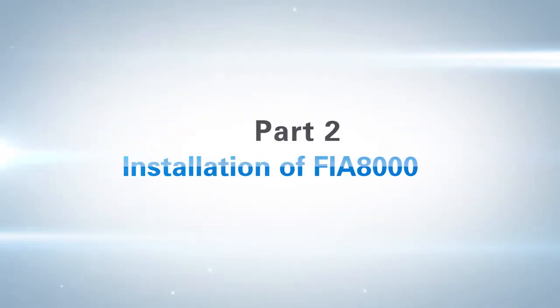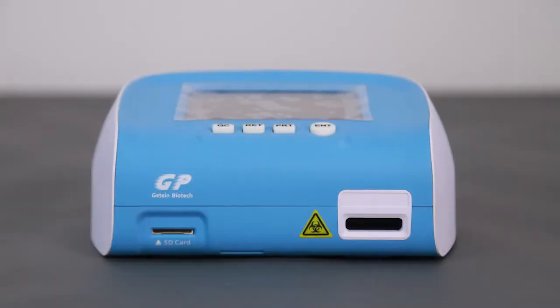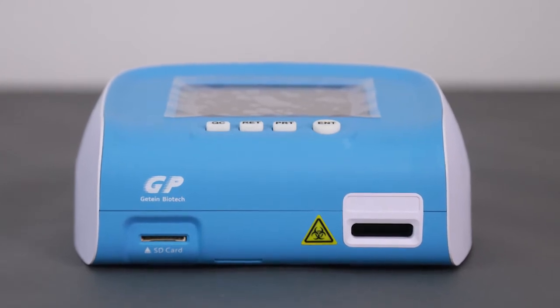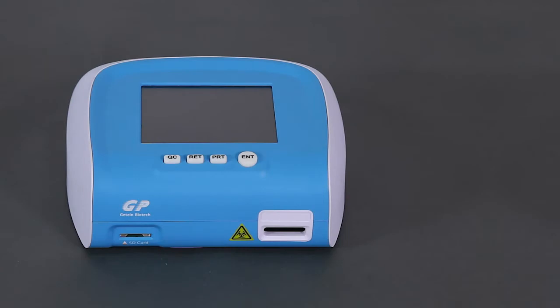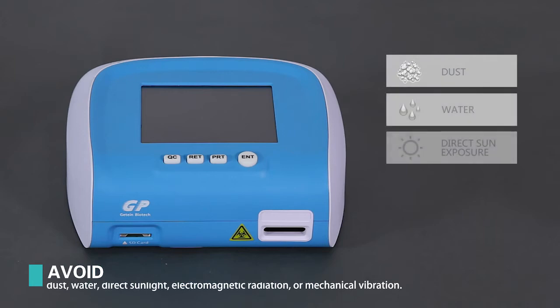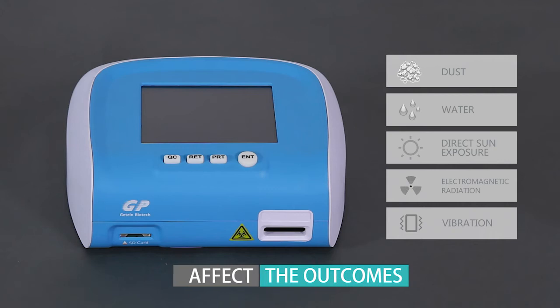Part 2: Installation of FIA 8000. The FIA 8000 analyzer should be placed horizontally on a clean surface which is large enough to perform the operation. Avoid places where it may be exposed to dust, water, direct sun exposure, electromagnetic radiation, or vibration, since these may affect the outcomes.